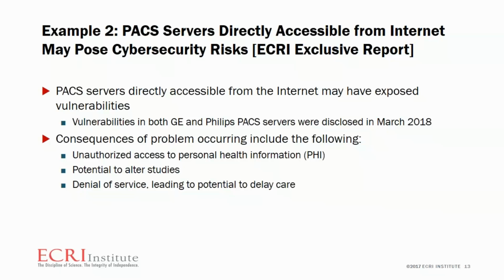Subsequent to the initial McAfee notification, we saw notifications from both GE as well as Philips focusing on their own PACS servers, which were also covered through ECRI's alerts. So again, this was a high-level alert in general, focusing on PACS servers and outlining what some of the consequences might be if a PACS server is suddenly not available.